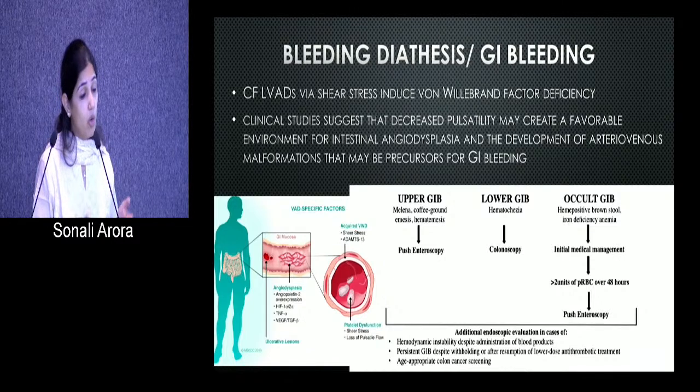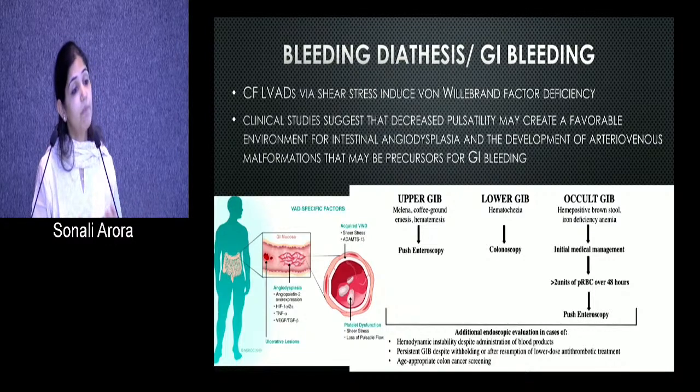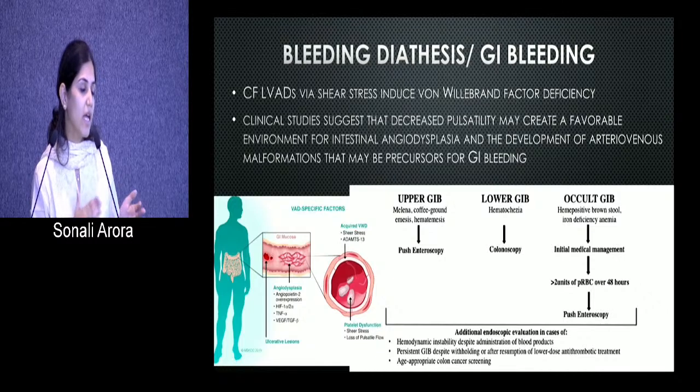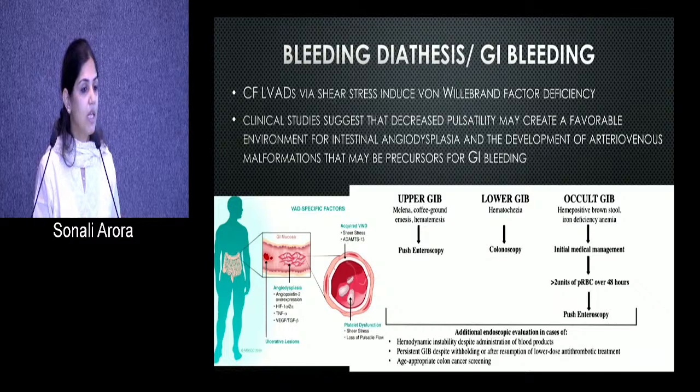Sometimes you have to lower your INR thresholds, or you have to cut back on the dual antiplatelet agents. Of course, that increases the risk of thrombosis or strokes in these patients. But the HeartMate 3 is kinder to you in terms of pump thrombosis or thromboembolic events. So rather than an INR of 2 to 3, you can say 2 to 2.5, and keep them on one antiplatelet agent rather than two.